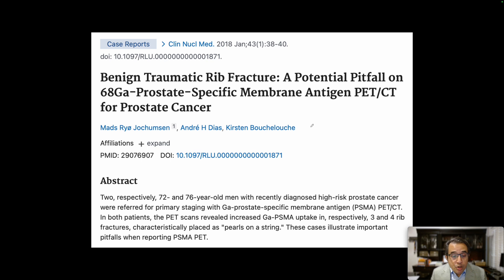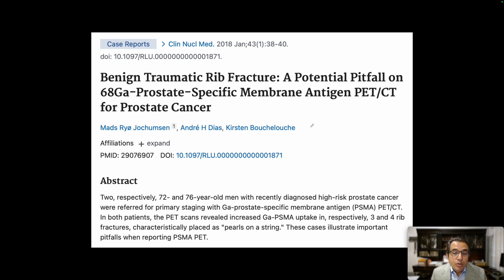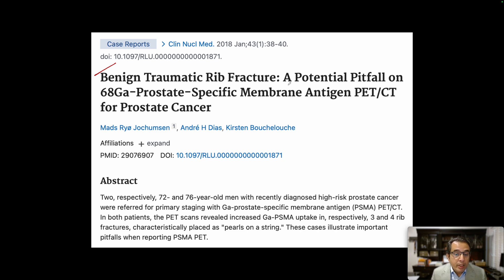Several case reports and case series have shown that there can be benign uptake in rib fractures of PSMA, confounding the diagnosis in patients with prostate cancer. A case report on this topic is titled: 'Benign Traumatic Rib Fracture: A Potential Pitfall on Gallium-68 PSMA PET-CT for Prostate Cancer.'